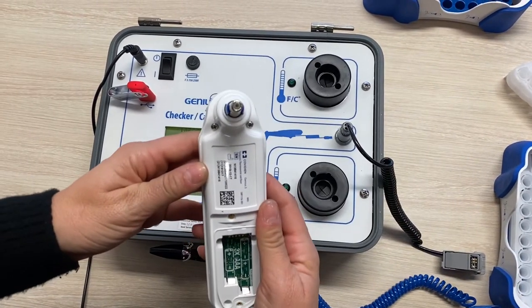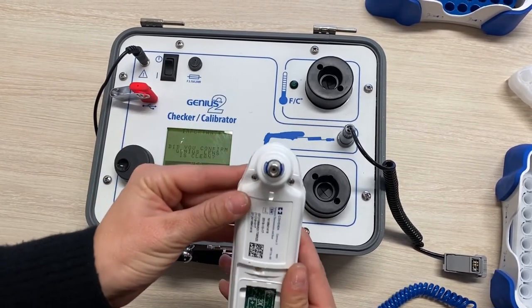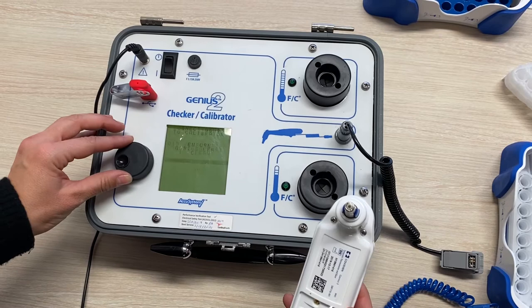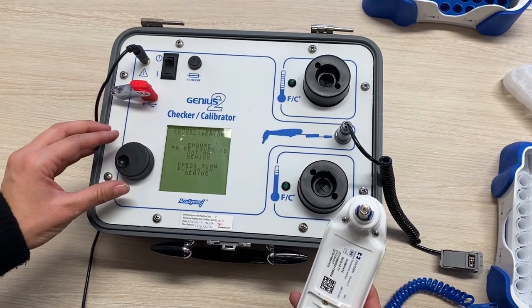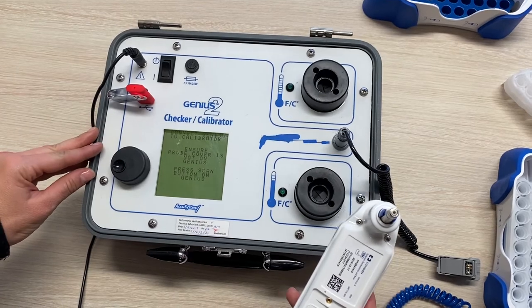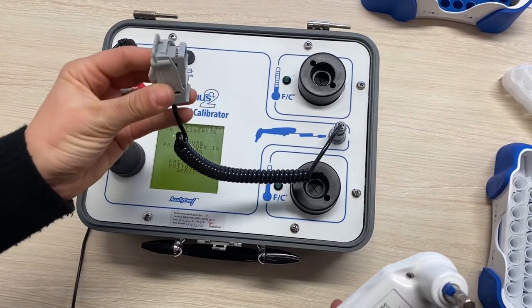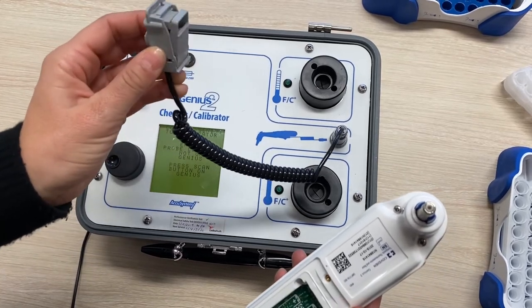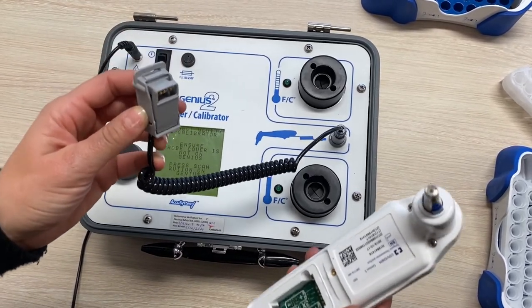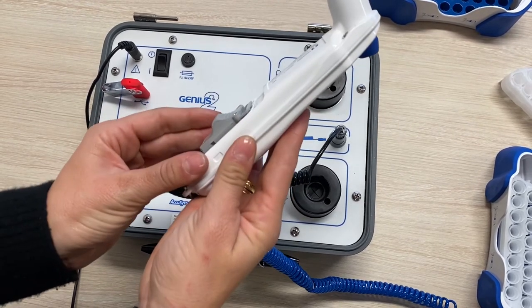You will then be directed to check that the lens is clean. Once you've completed this, press to continue. At this point you will connect the thermometer to the calibrator using the cable. Make sure you have the right cable for the right thermometer model. The cable for the G3 is gray in color, as you can see. You can clip it in like so.